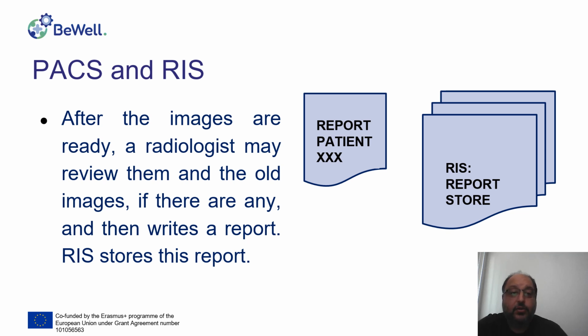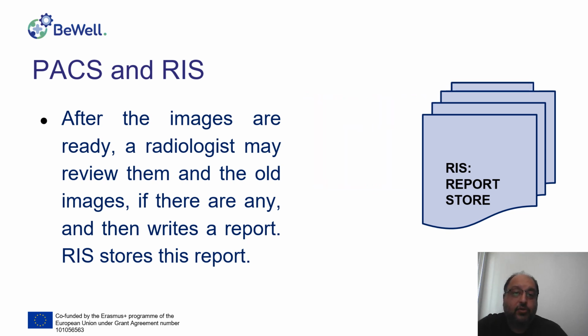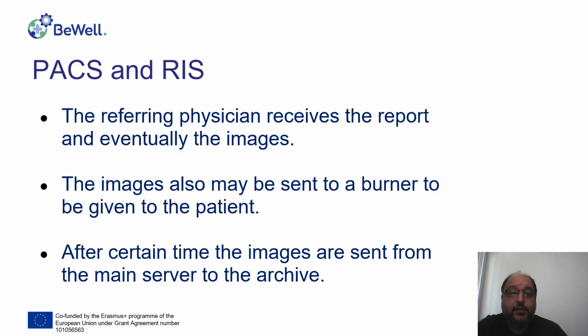Then, once the radiologist reads the images and prepares the report, it is stored in the radiology information system. The referring physician may look at the report and eventually the images if the report is not clear or requires some additional information. The images can also be given to the patient. They are sent to a DVD or CD burner to be burned on a disk and given to the patient because the patient may need to go to another facility in order to be checked or just to have information for further situations.